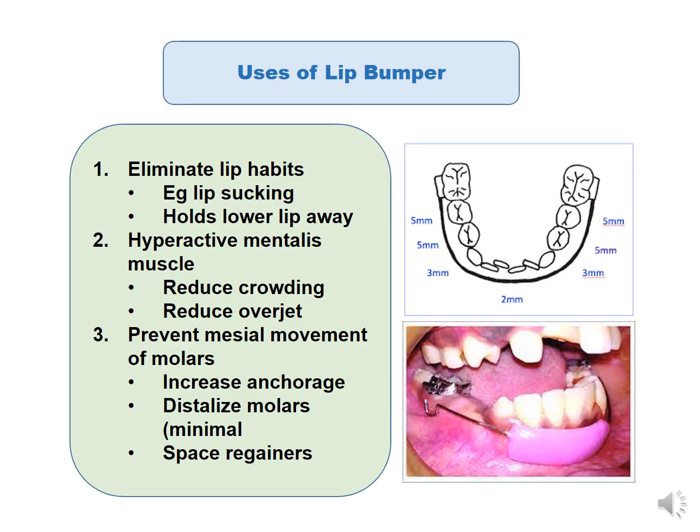Now, since it's attached to the lower molars, it prevents mesial movement of the molars, which can increase the anchorage value of the molars. It can also be used to distalize molars, though the effect is usually minimal, and it can also be used as a space regainer.